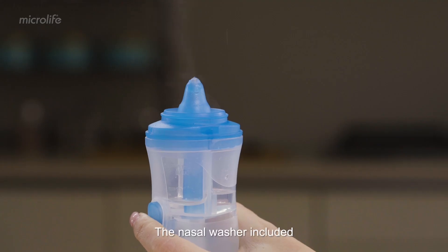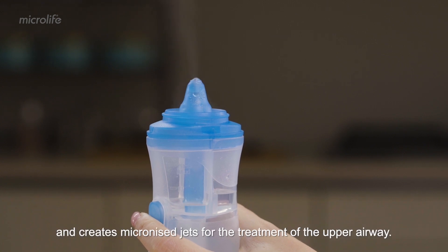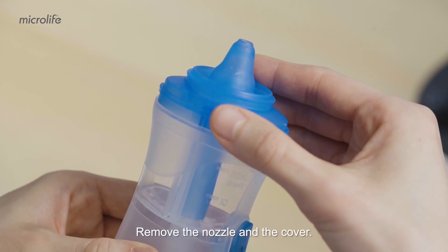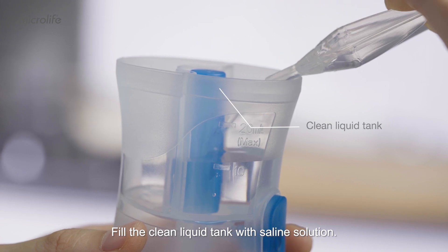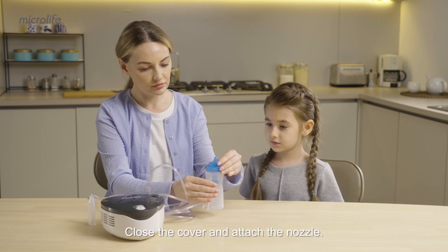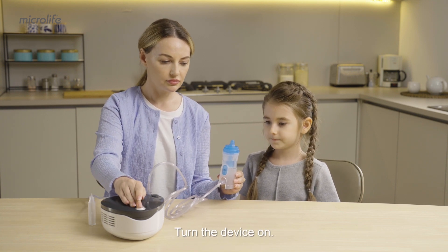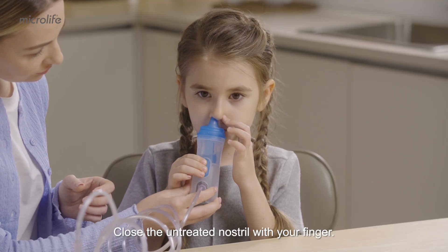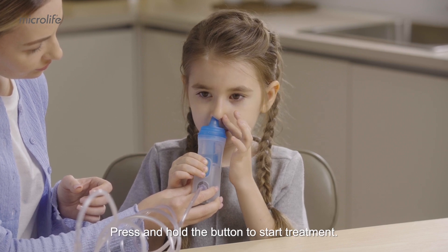The nasal washer included helps moisturize the nasal mucosa and creates micronized jets for the treatment of the upper airway. Remove the nozzle and the cover. Fill the container and attach the nozzle. Connect the air tube and turn the device on. Place the nasal washer close to the nostril. Close the untreated nostril with your finger. Press and hold the button to start treatment.